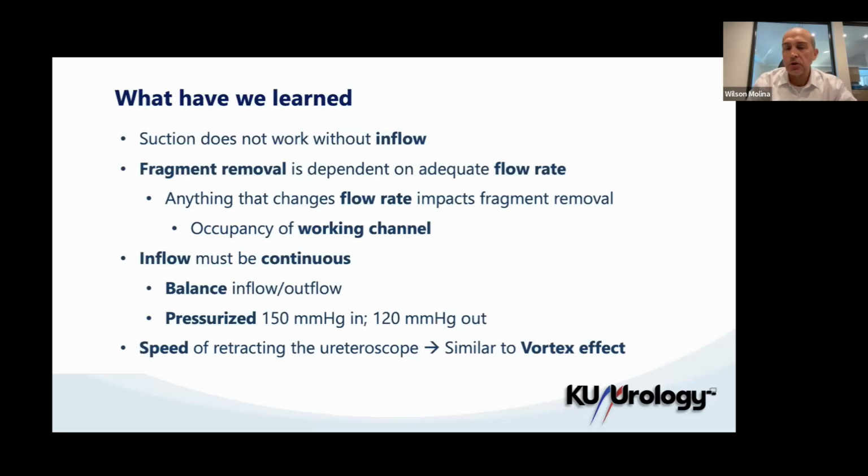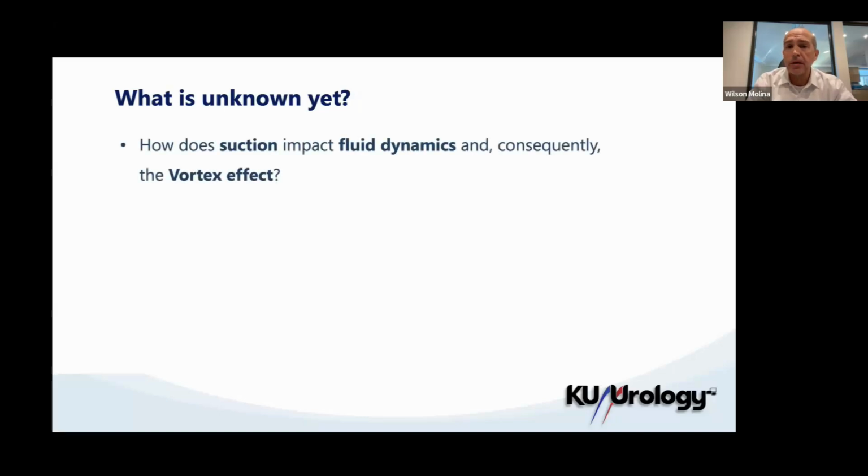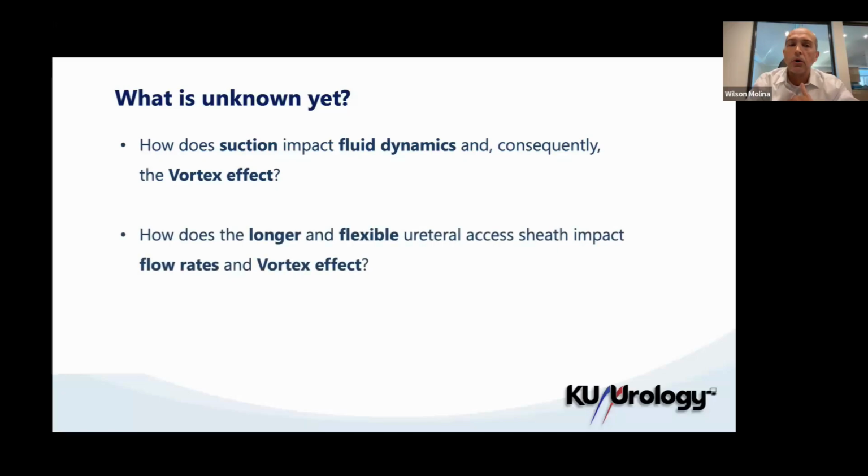But unfortunately, at this point, we have not yet studied the hydrodynamics of this. So what's still unknown? How does the suction impact the fluid dynamics and consequently the vortex effect? How does the longer and flexible ureteral sheath impact the flow rates and the vortex effect? Those are unknown topics.